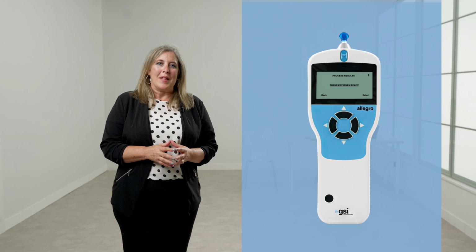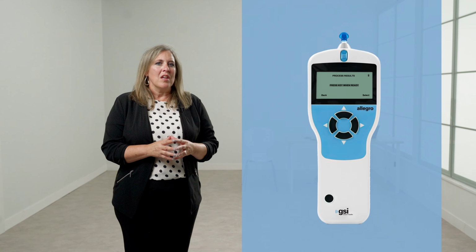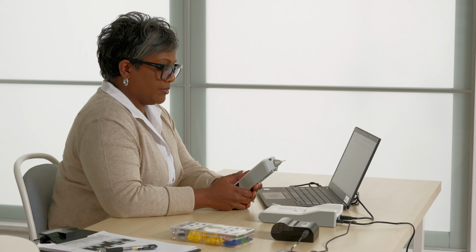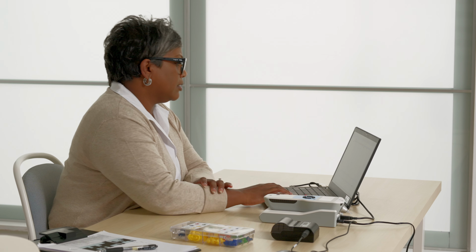When the test is completed and the results are accepted, the Process Results menu will be displayed. From here, it is possible to print or save the results, view the test again, or return to the main menu. Please note that the results of the last test performed remain available even if the Allegro has been turned off. However, the results of the last test will be erased as soon as a new test is started.